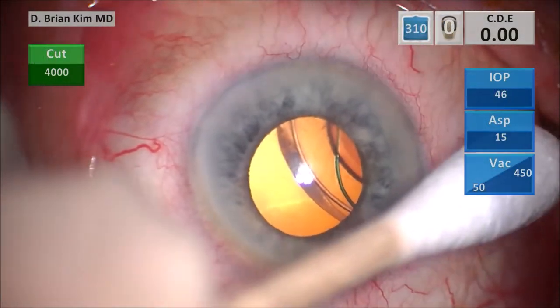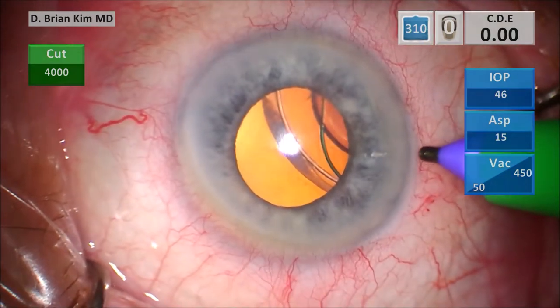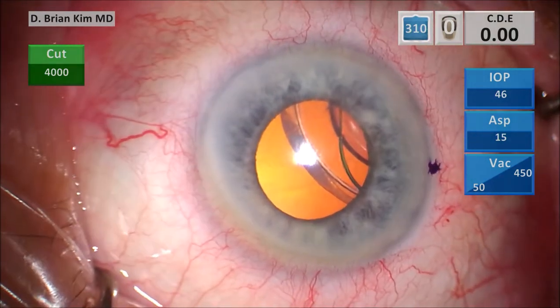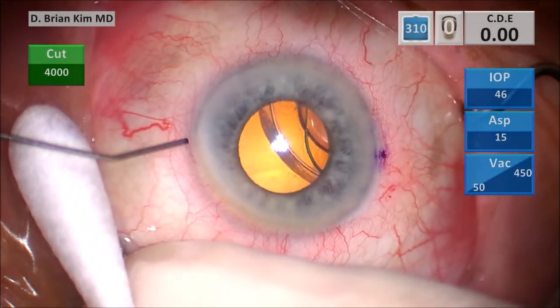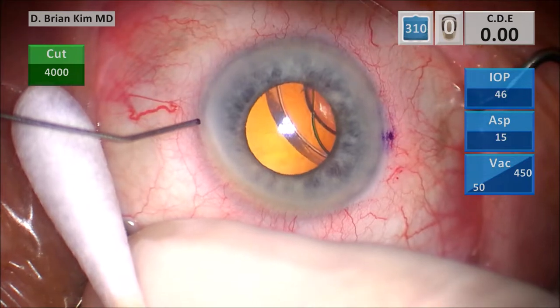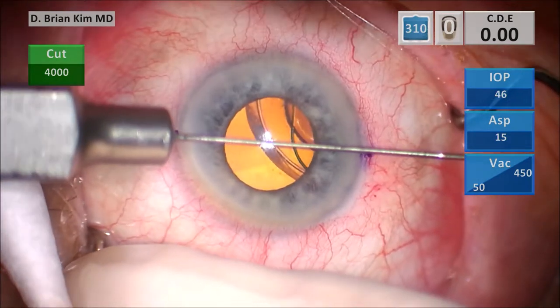You can see the capsular bag, the CTR, as well as the three-piece lens here. I'm marking the limbus with the ink pen and then using the cannula to find 180 degrees apart. I also have that cannula pre-marked at the tip, and I'm able to mark 180 degrees apart.